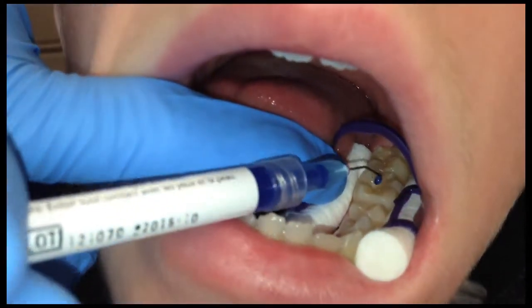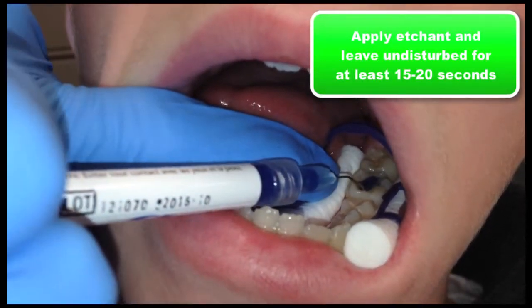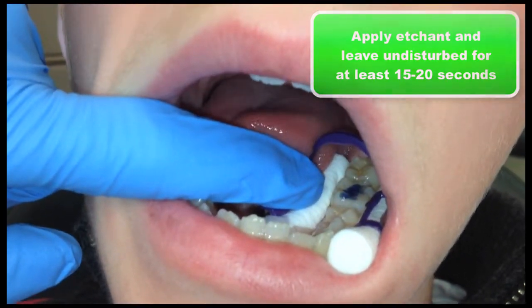The next step is to apply your etchant. Application time is 15 to 20 seconds. We use gel etchant. Apply and leave undisturbed.